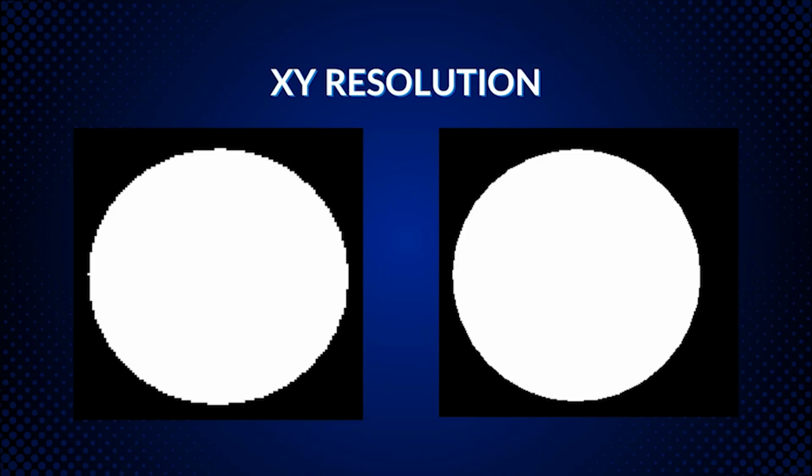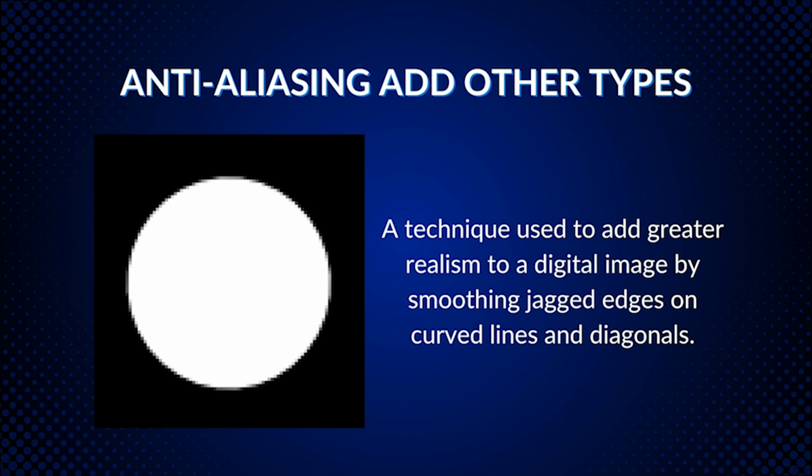As you can see in the view there, the left and right, you see in a 2-dimensional format the XY steps. Anti-aliasing is what the slicing software does if you have super sharp details. Let's say I'm printing a circle like shown in the picture.